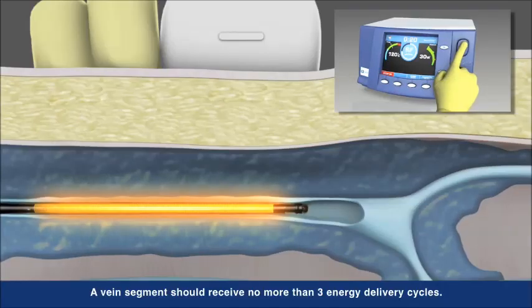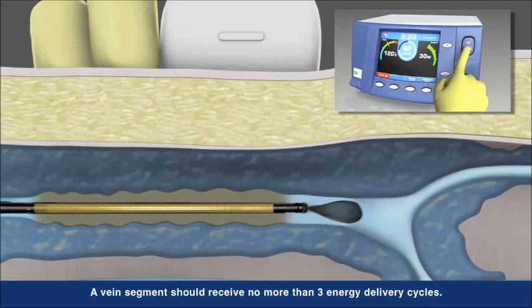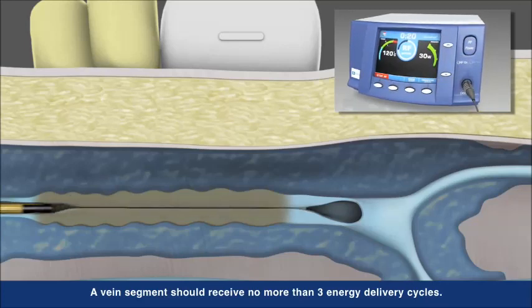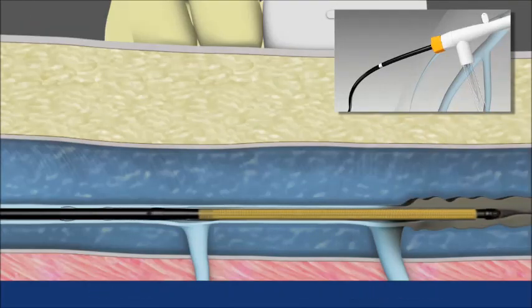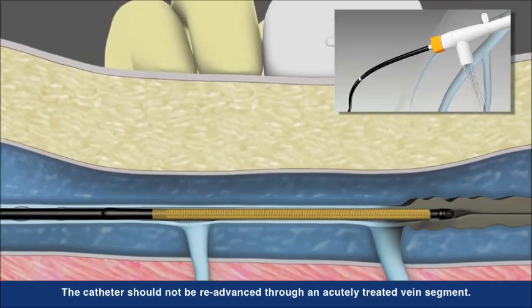Working together with the closure RFG generator, the catheter is designed to deliver controlled, consistent heat to each segment. After each segment is treated, unique shaft markings on the catheter aid proper repositioning to the next segment.